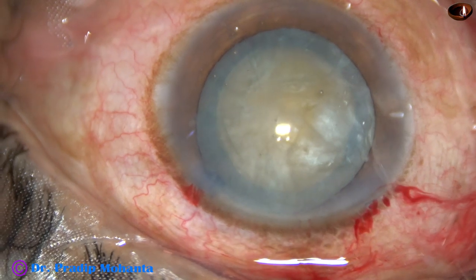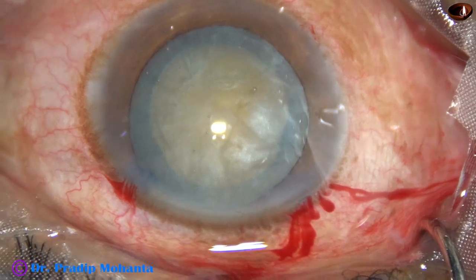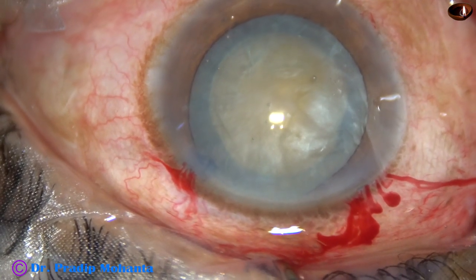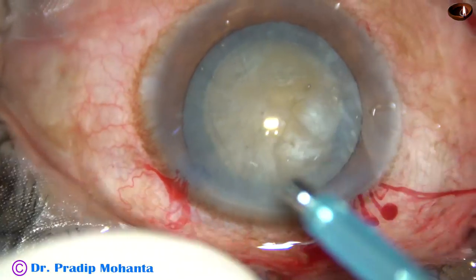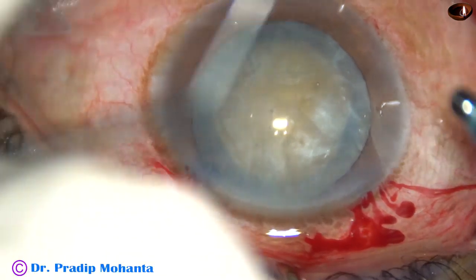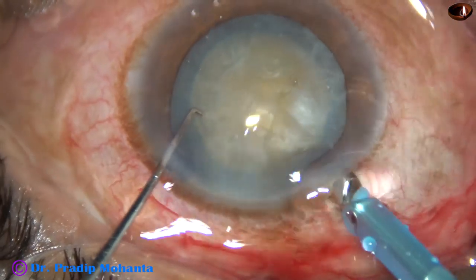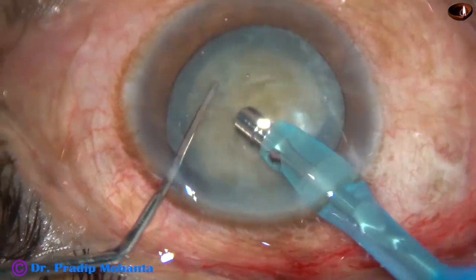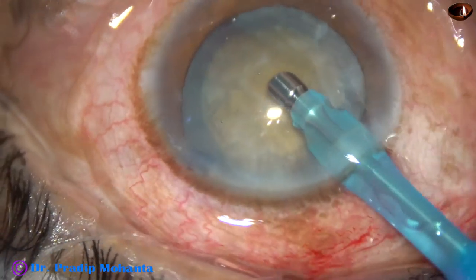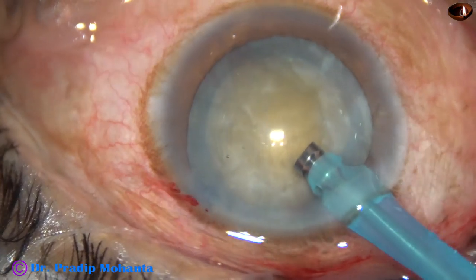Viscoelastic substance is injected again, and now the tip of the phaco handpiece is introduced into the anterior chamber. The machine being used is the Oertly Cataracts 3. The tip first goes in with its bevel down, bevel towards the nuclear mass. Since the cataract is quite hard, the exposure of the tip is a little more than what is used in soft cataracts.